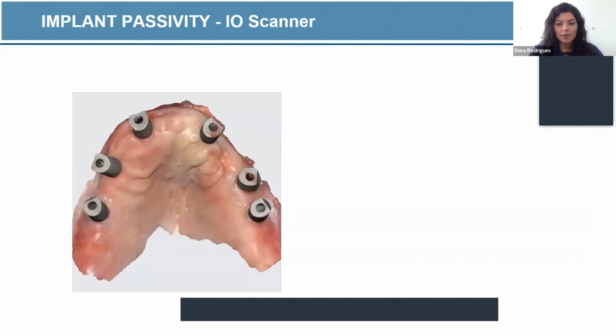So it's really hard to scan full arch intraorally, and this is changing. I just saw Trios 5 a week or 2 weeks ago, and it's amazing how well it captures everything. So 2.5 years ago, when I was going to the digital workflow, for me at the time, it was not possible to believe in full arch intraoral scanning. The reason is because the span without teeth is really big.